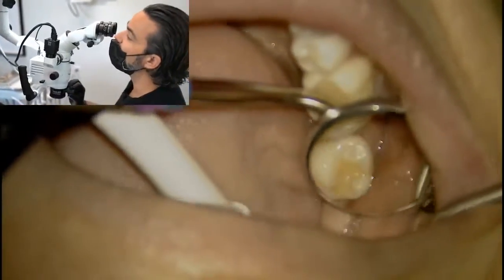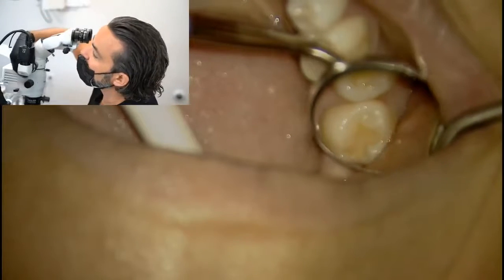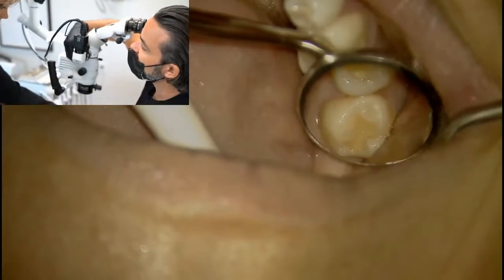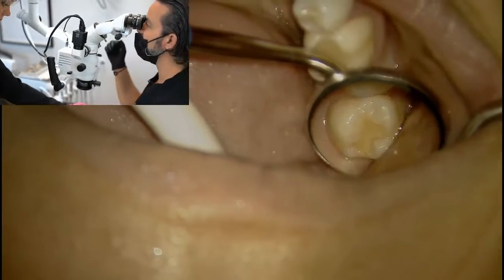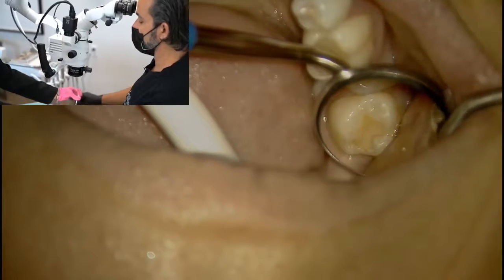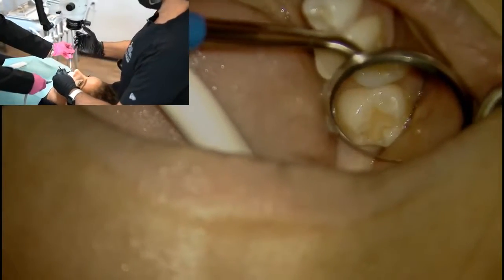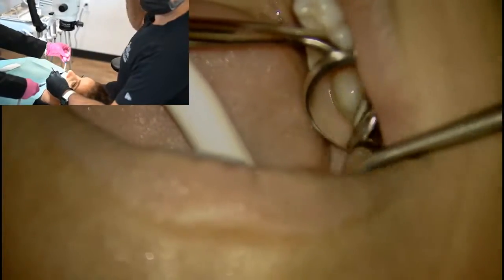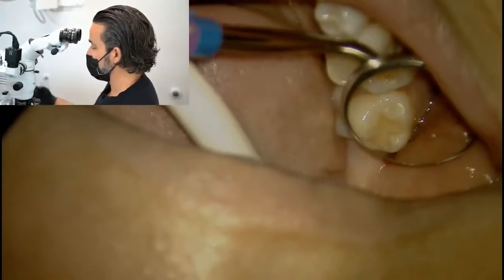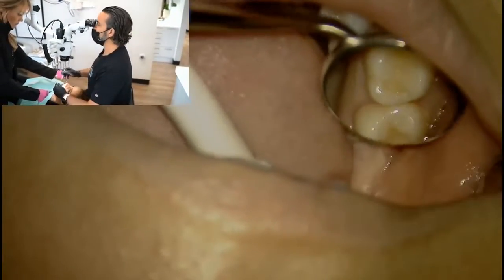And there we go. Now I'm going to get you guys in focus on the screen, which is a different length than I'm looking at. There we go. All right, so Vic, you can hand me this explorer. Now, this is the posture. And now you can see where I'm at, where my neck is at, Michael, and my body position, my arms and my shoulders, and my explorer.